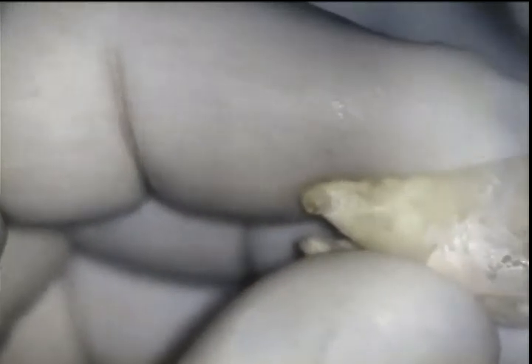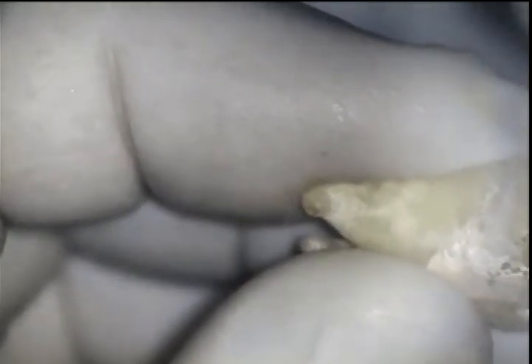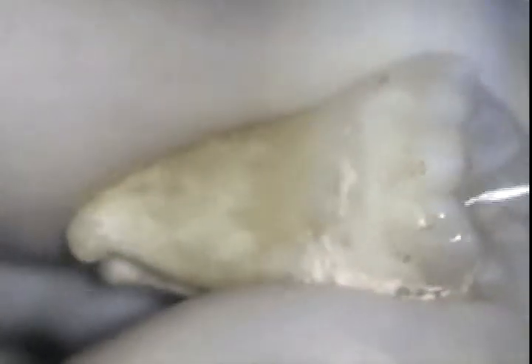Please note I am going slightly over the length of the root. In the mouth, I would only be going 0.5 millimeters beyond the constriction, taking me to the apical foramen, but not outside the confines of the root.